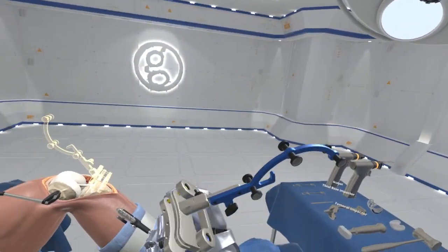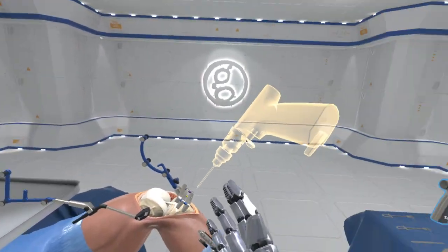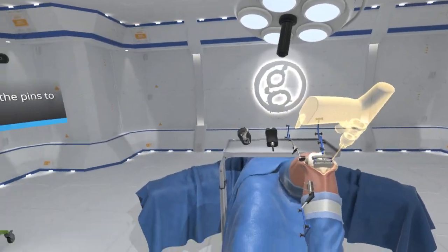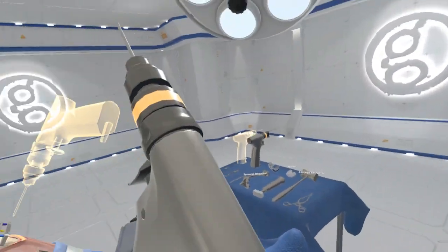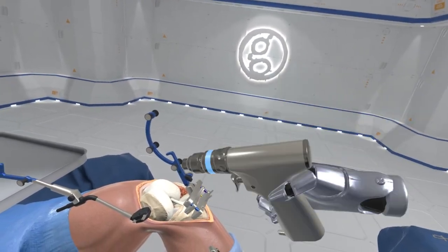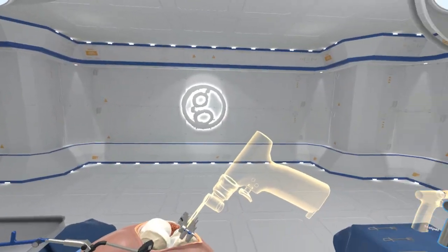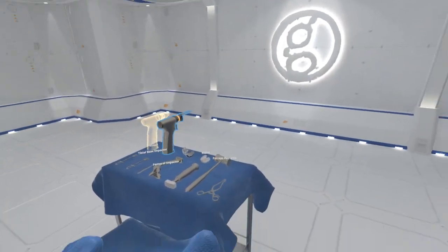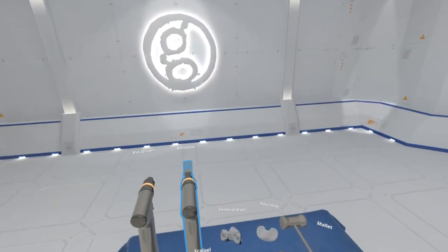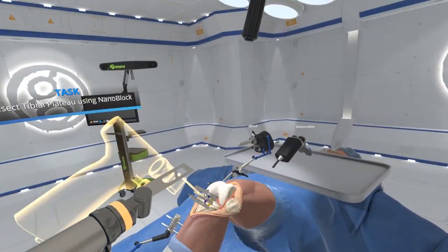Position the nanoblock over the tibial tuberosity. The target array assists in placement. 3 anchor pins are required to anchor the nanoblock. Grab the pin driver. Grab the bone saw to resect the tibial plateau. Place the blade into the resection guide on the nanoblock to resect the tibial plateau.